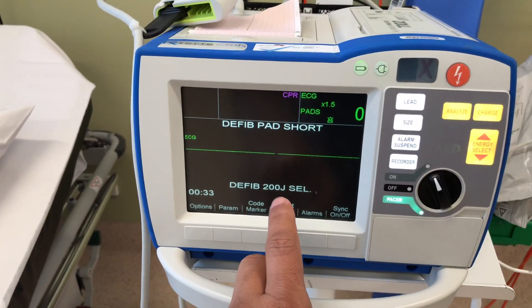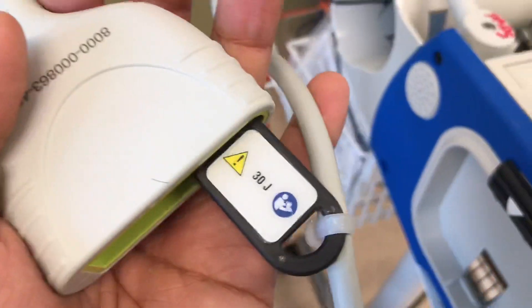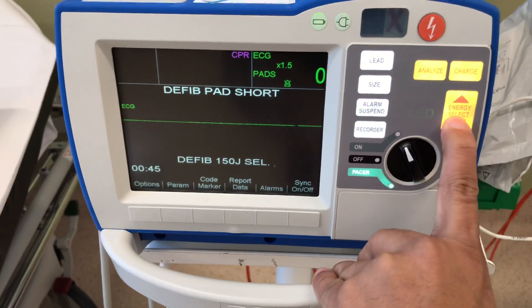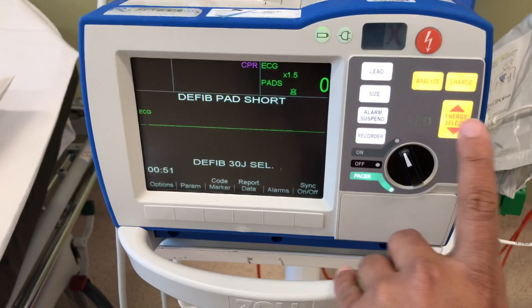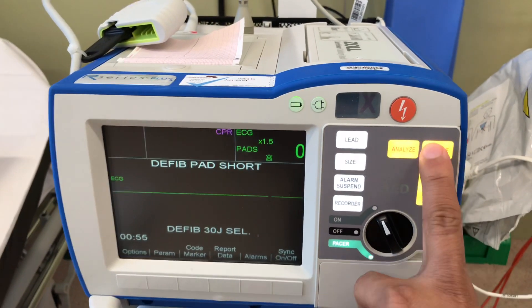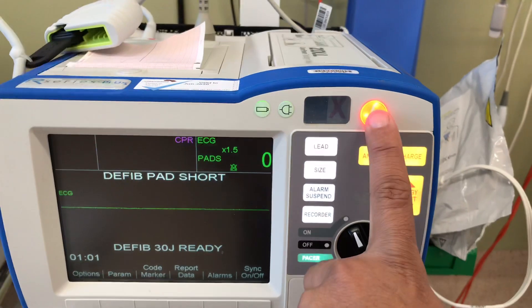It's already selected at 200 joules. This test lead actually tolerates 30 joules, so I have to select 30 joules here. I'm selecting 30 joules. I have selected 30 joules. And now I have to charge it, so I'm clicking the charge button. It's charging now. And now it's ready for 30 joules, and I'm going to click the shock.